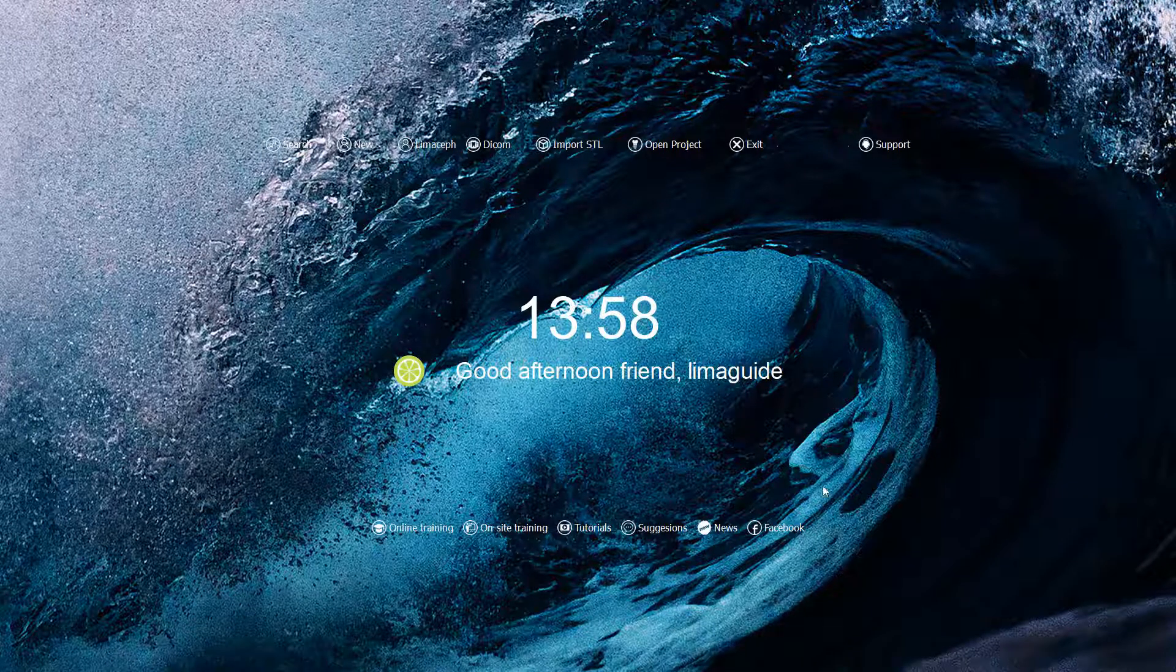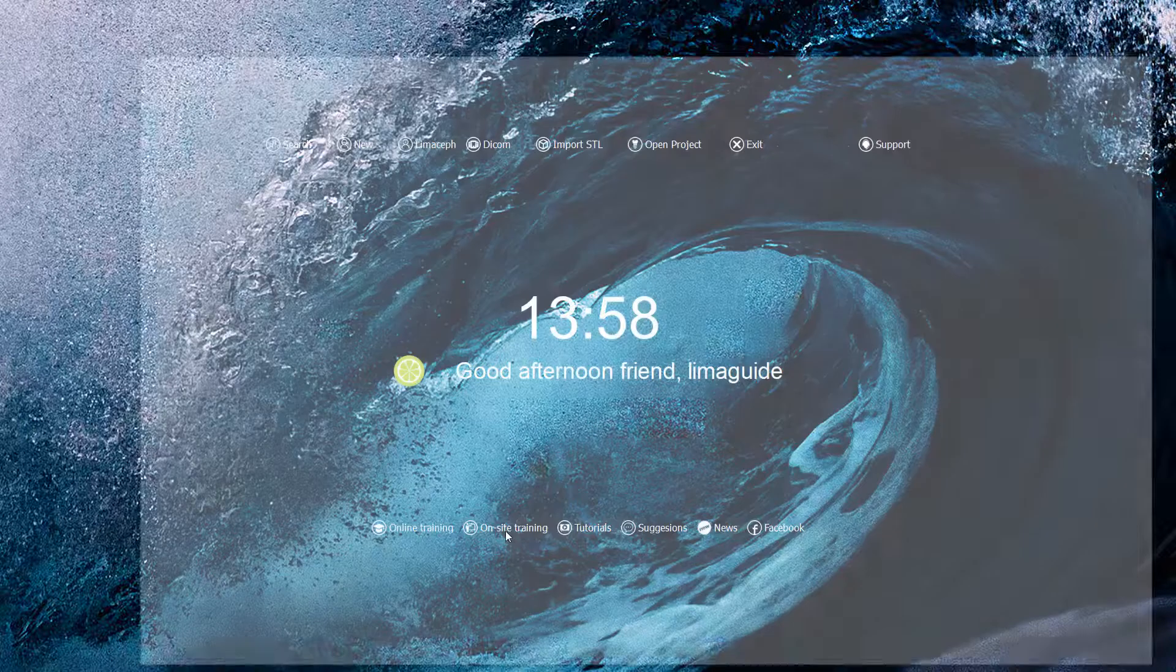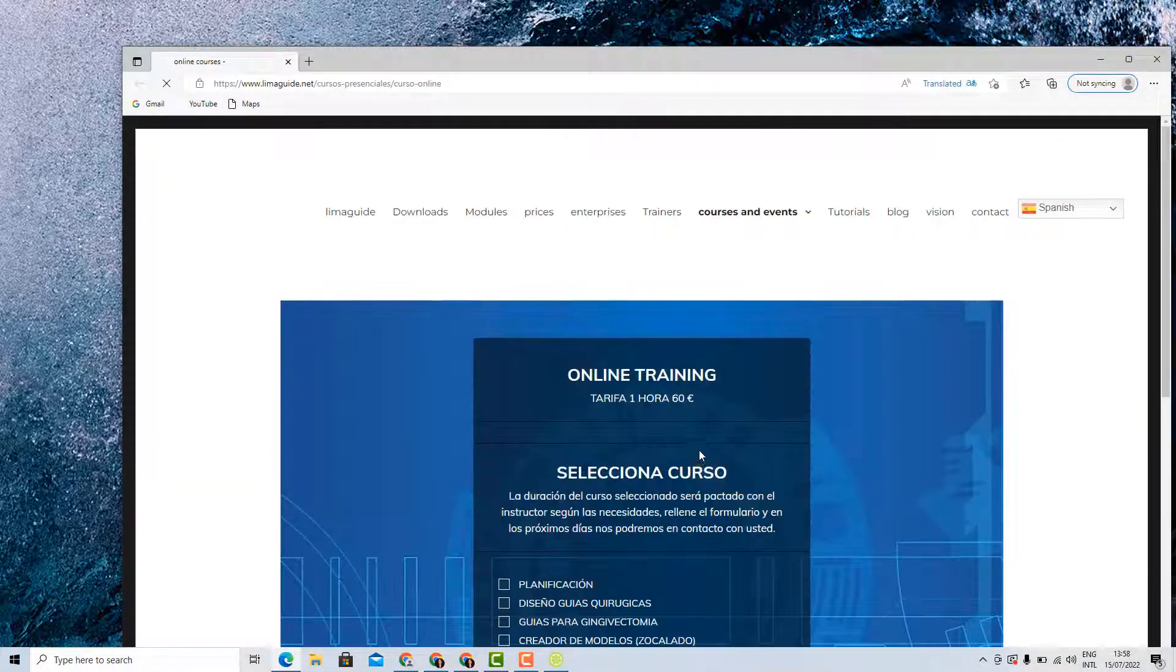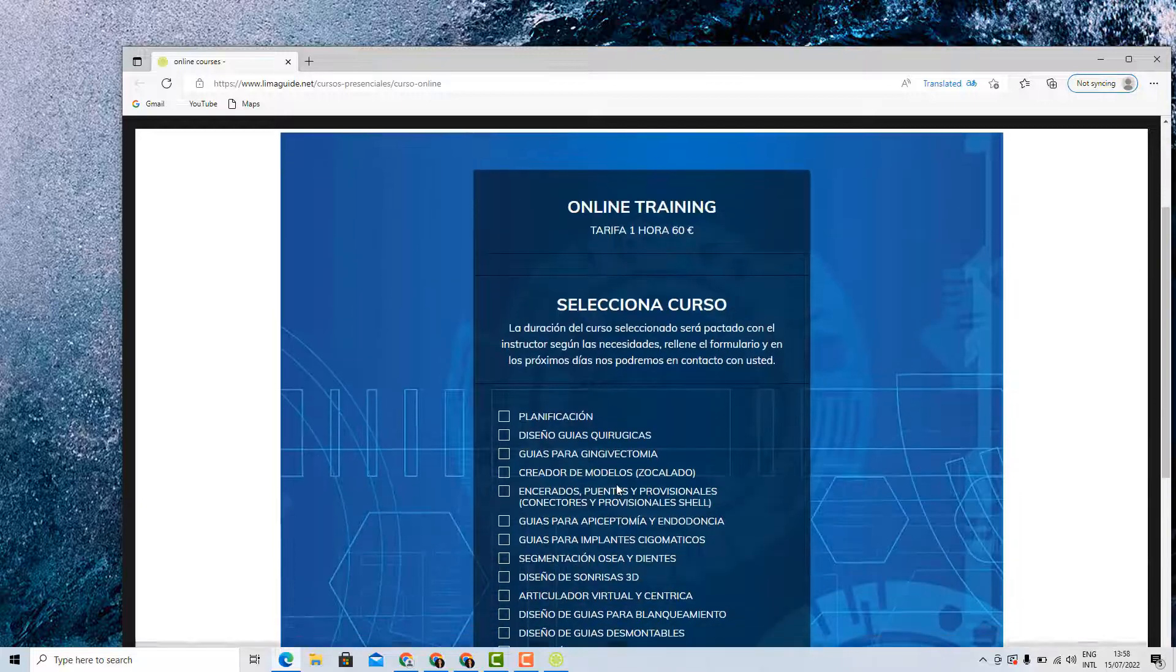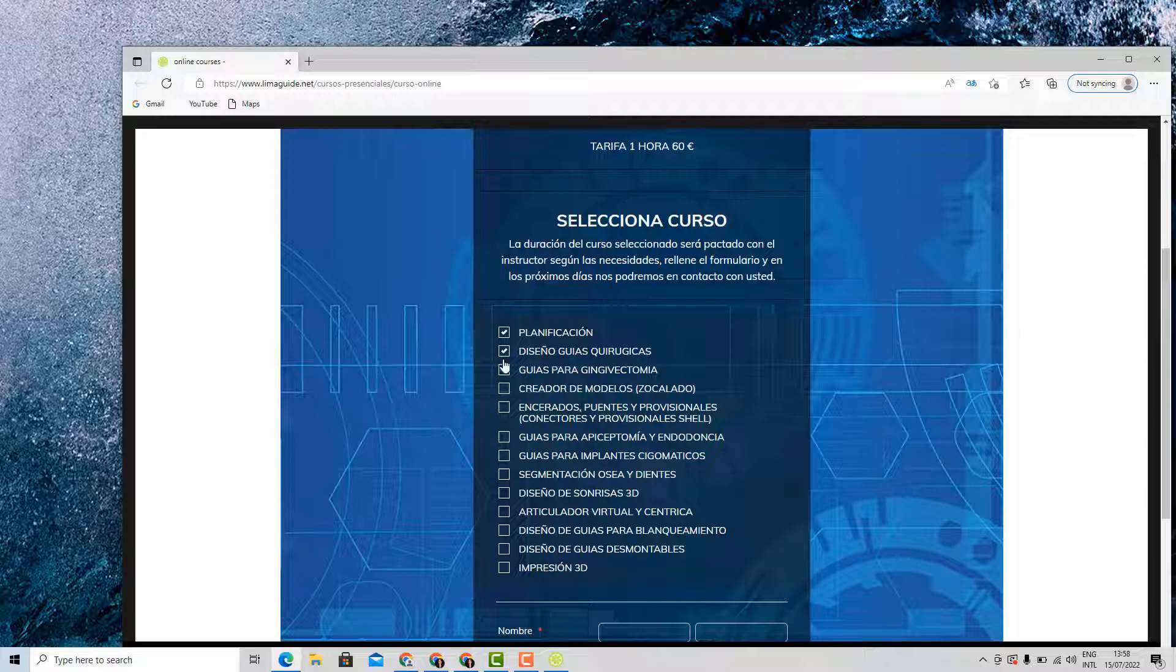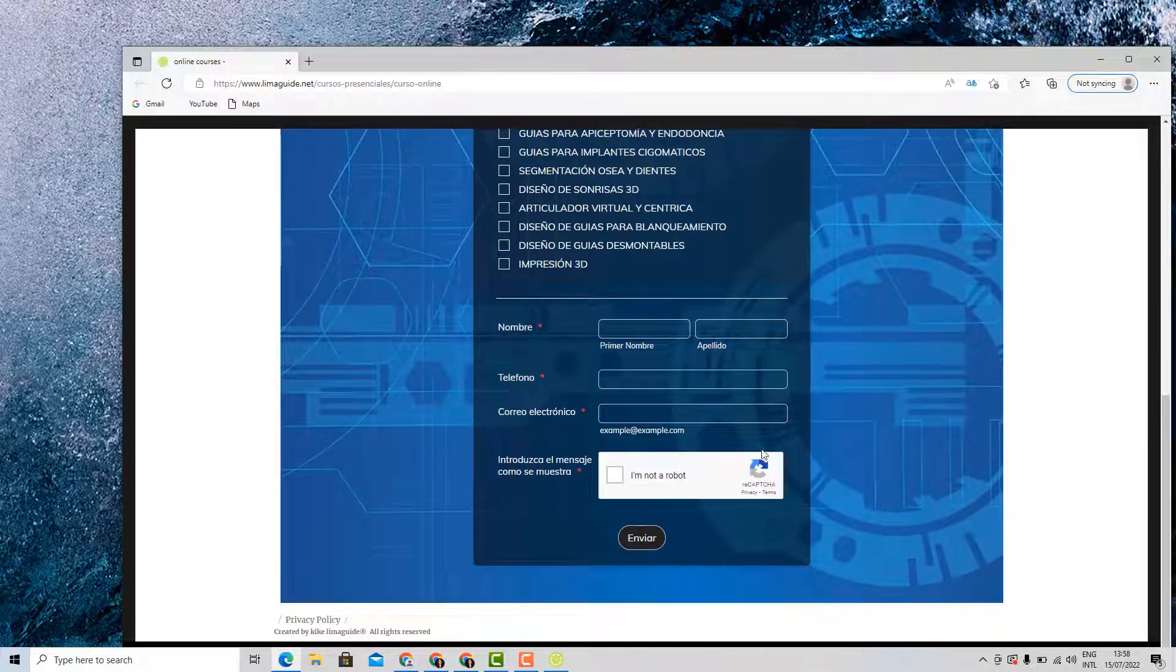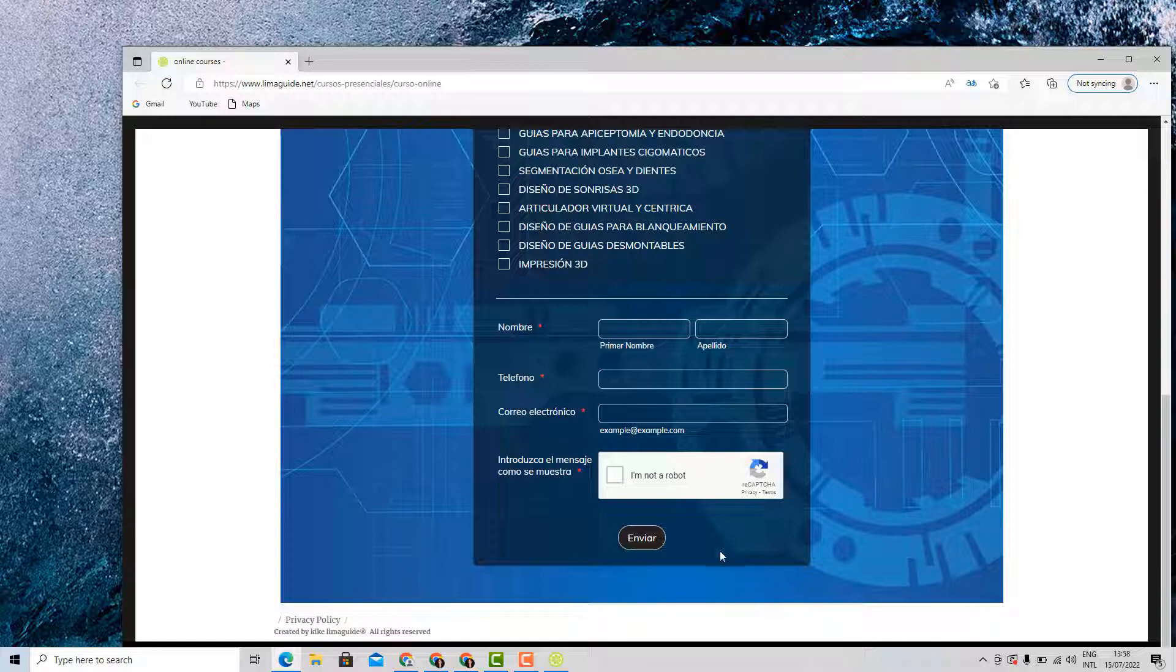What you can see once you open Lima guide on the upper and lower part of the screen are different functions. For example, the online training is to select online courses about planification, about designing surgical splints or designing guides for doing a gingivectomy. You fill in your personal information and you send the request.